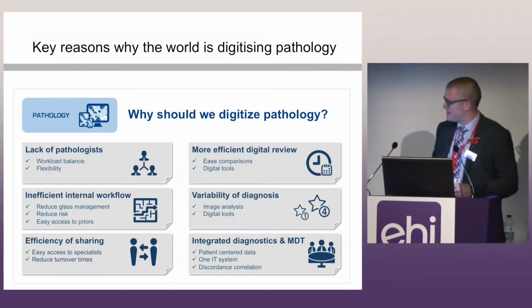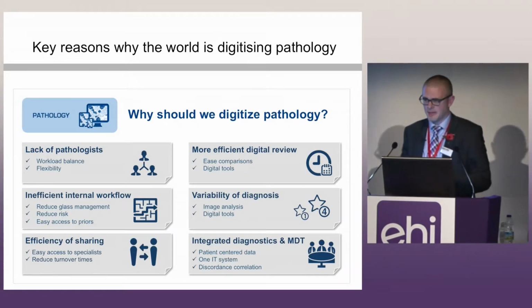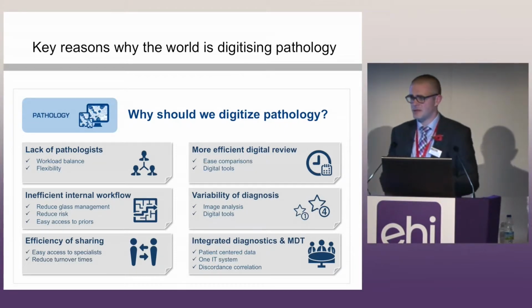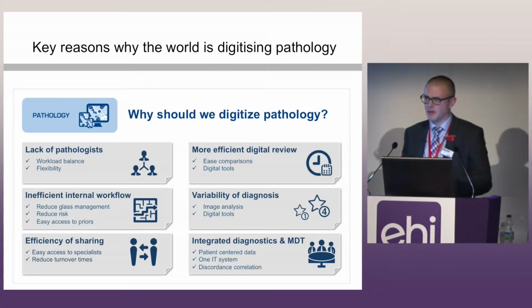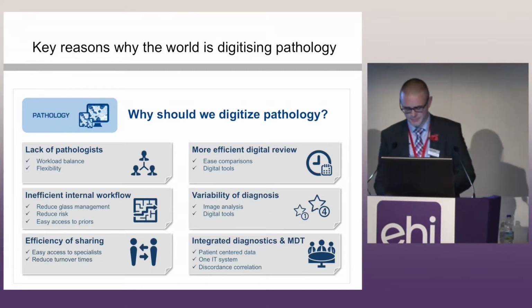And finally, and it is a point that I will come back to a number of times, we really need to be thinking about the integrated diagnostics piece. If your hospitals or your trusts or your organisations are having conversations about digital pathology and not including radiology and leveraging the infrastructure that you have already invested in, then I suggest that you may well be having the wrong conversations. I think it's very important to leverage that investment both in terms of economies of scale, but also in terms of patient care. Really, really important.